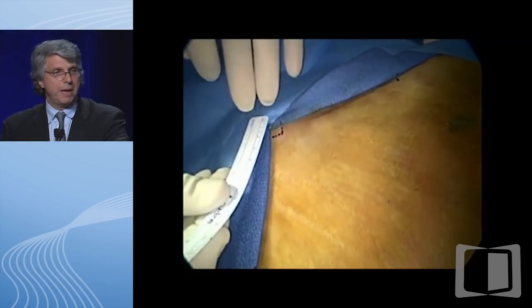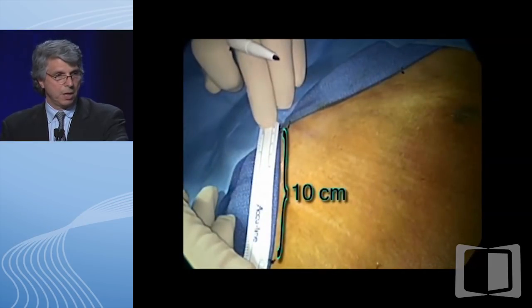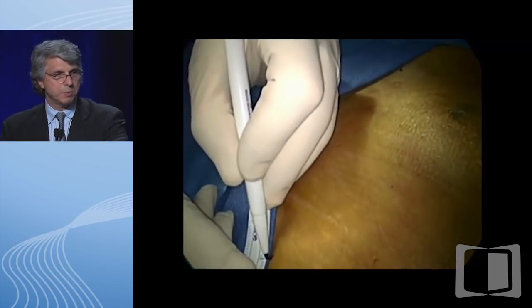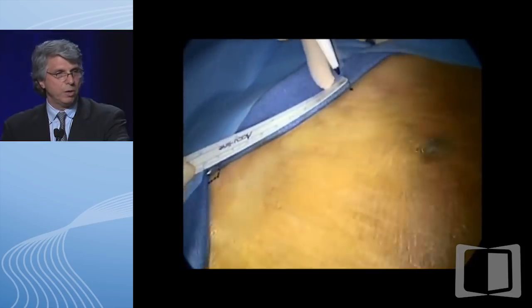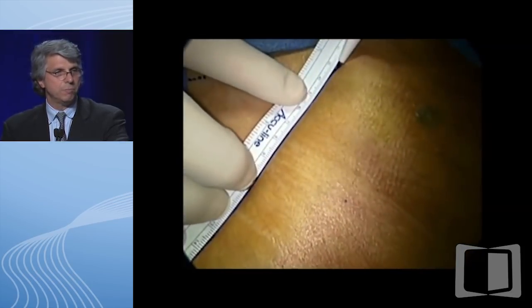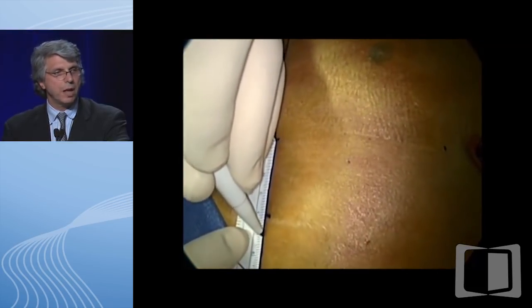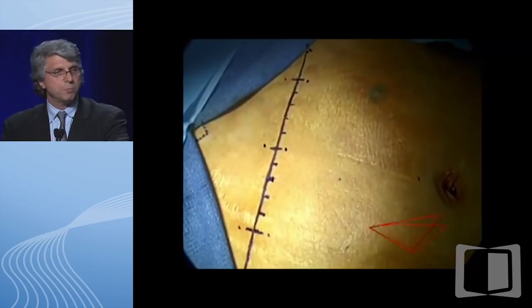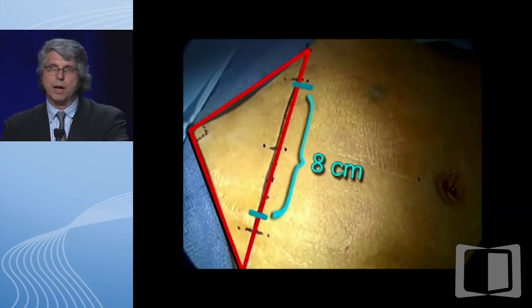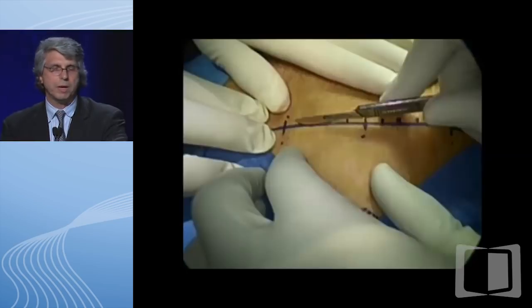This is a video. Imagine you're sitting on the left-hand side of the patient. There's a blue dot at the upper right—that's the proposed ileostomy site. What we're marking off now is a right-angle triangle to make a Pfannenstiel incision. Most of us now do these in Pfannenstiel incision, though there's a big controversy over that.